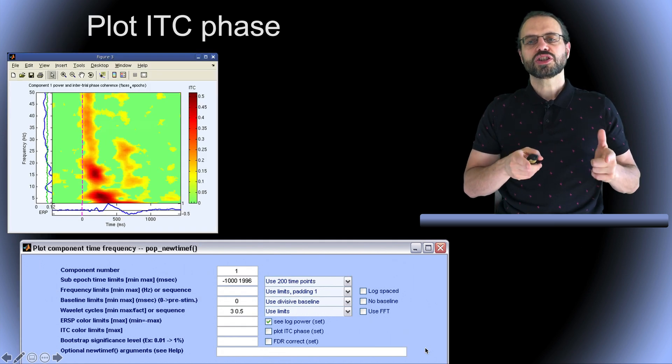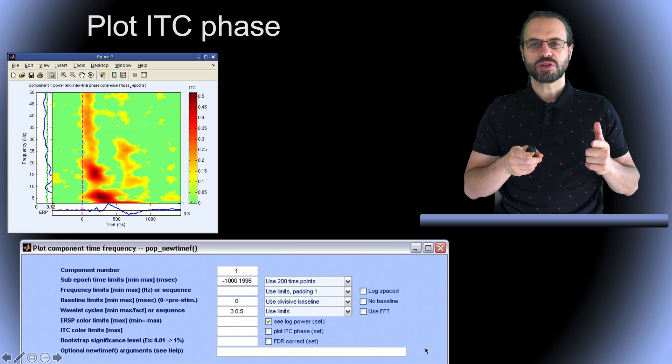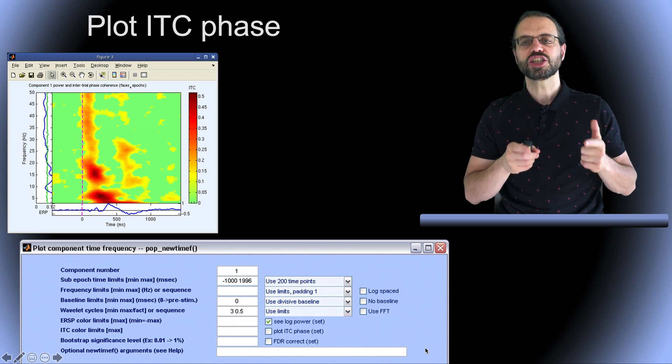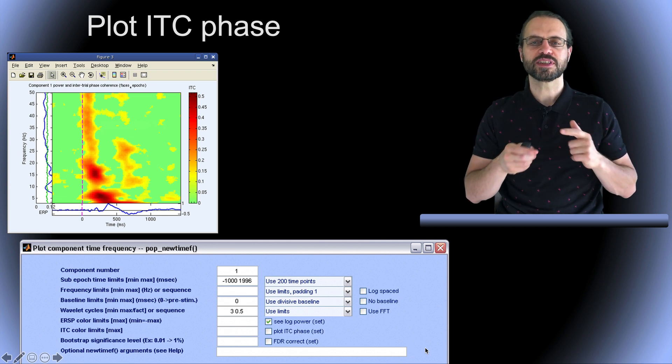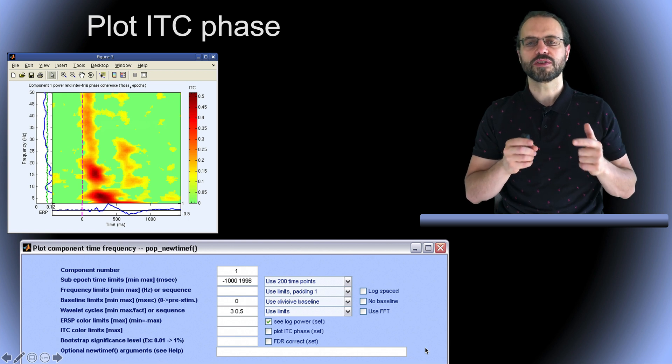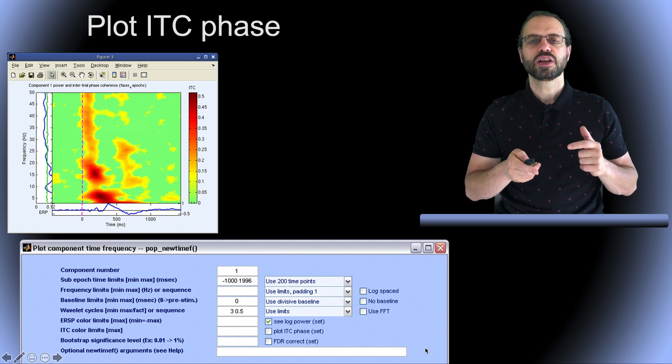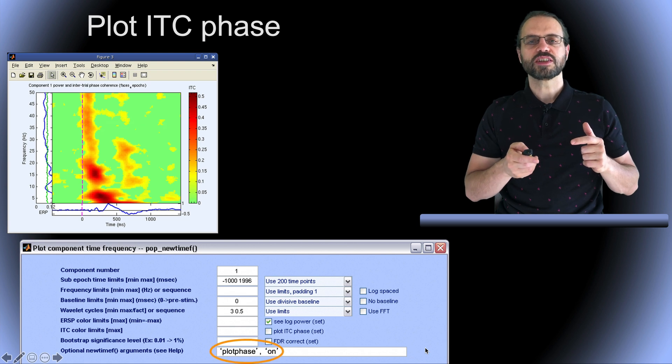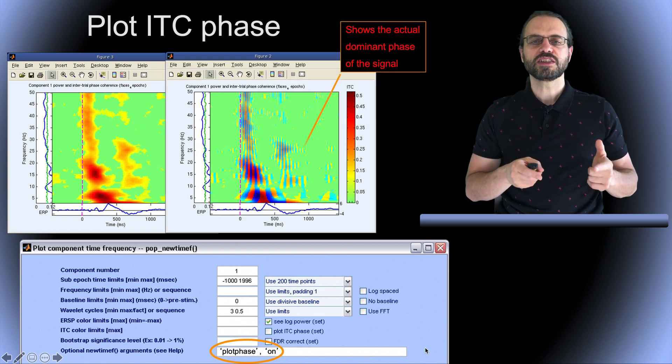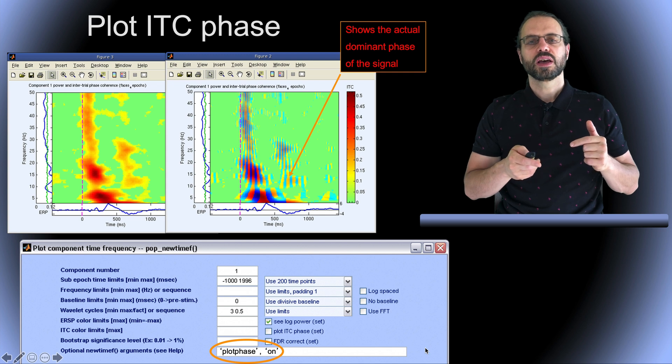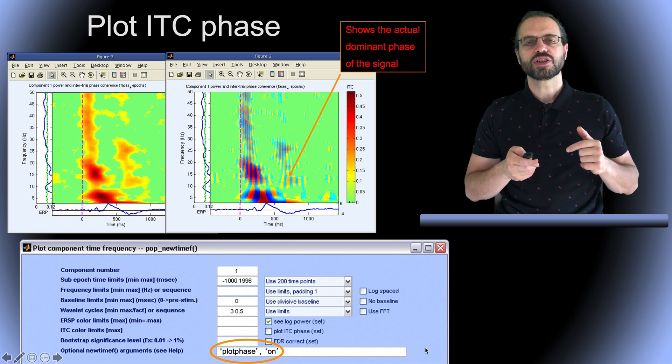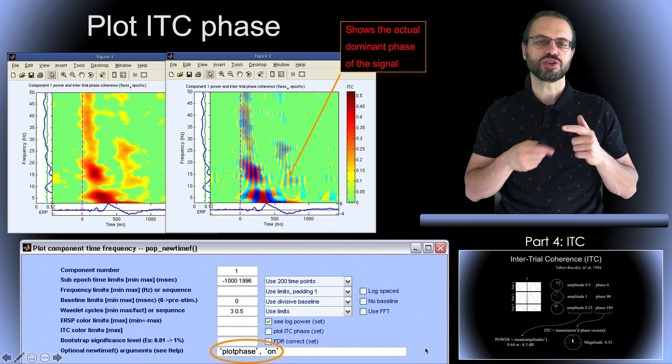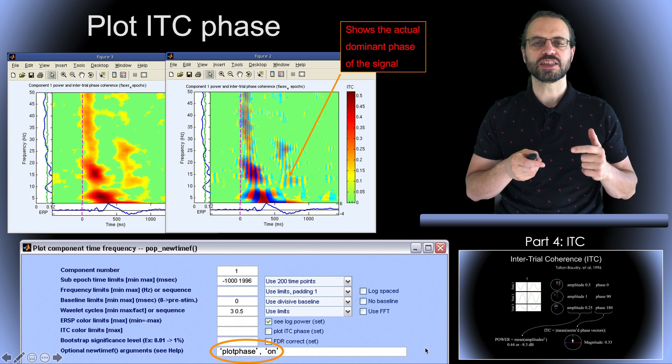This is now just plotting the intertrial coherence or ITC. When plotting ITC, there are additional options that allow you, for example, to plot the phase of the ITC in addition to its amplitude. So when you use the plot phase options, you are now able to see the phase of the ITC. You may look at presentation number four in this series for what I mean in terms of phase and amplitude of the ITC.